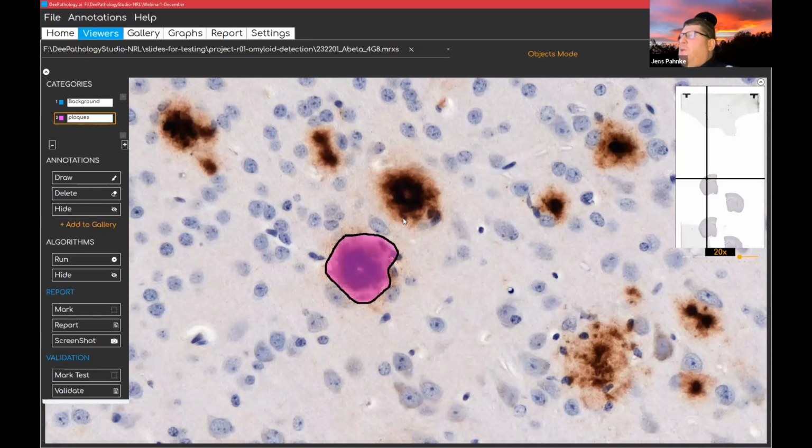So this is in the violet, so I take another one. I have to give some examples to the software of what I actually want to have. It is very important that you do it properly because this is an example. It should be a perfect example for the machine for learning. It will give you later some other possibilities where you can always choose the best.